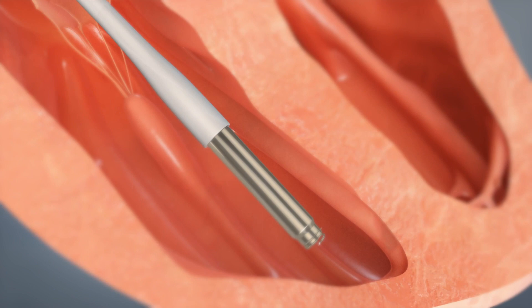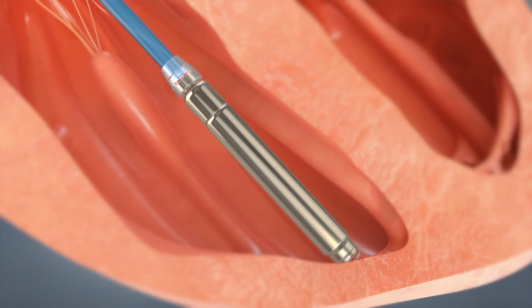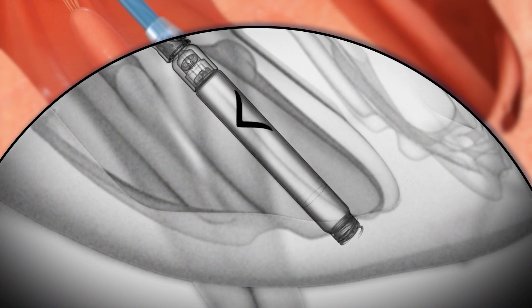Subsequently, the guiding sheet is removed and the pacemaker is exposed, at which point the pacemaker is advanced into the heart muscle. The operator then performs an active fixation screw-in mechanism which allows fixation of the leadless pacemaker into the heart muscle wall.